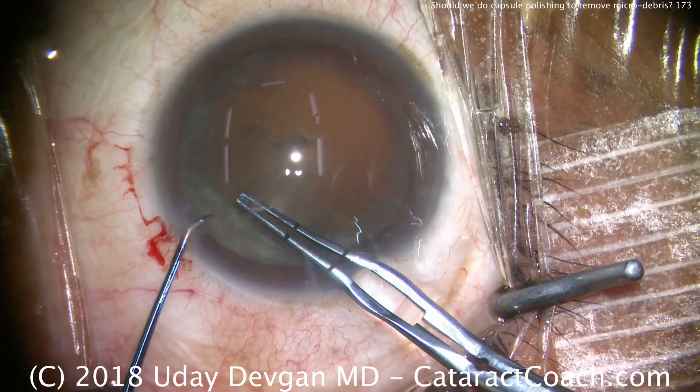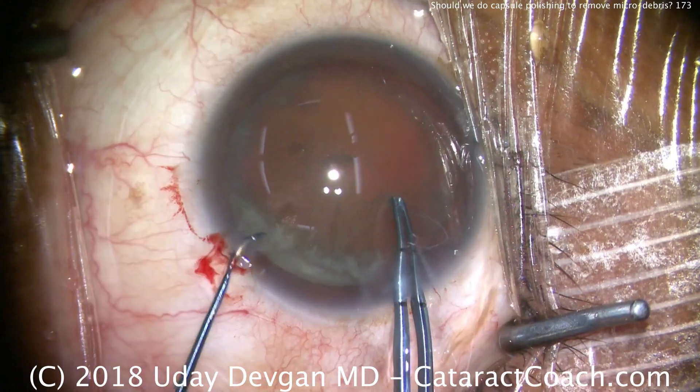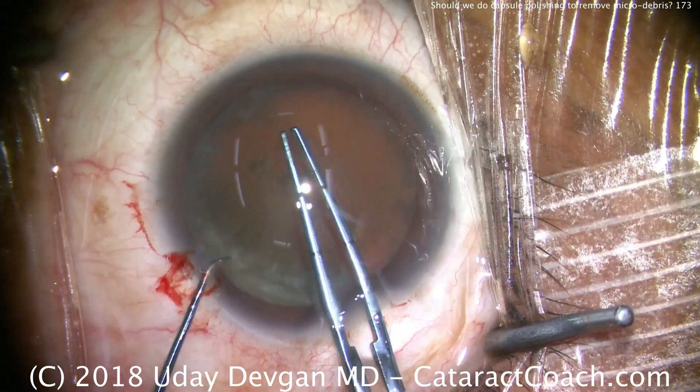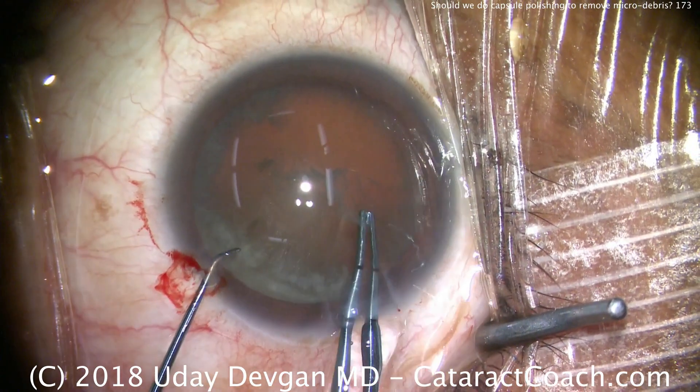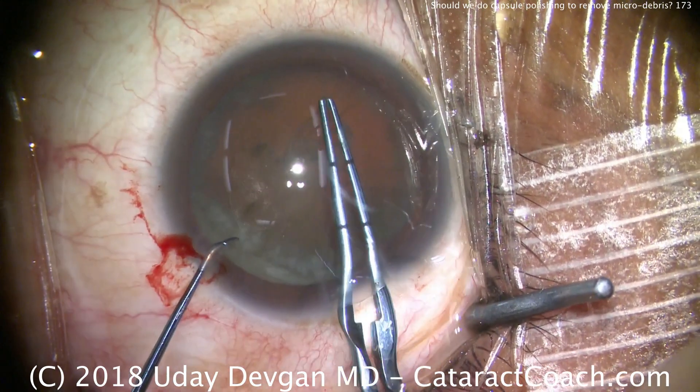Notice how I grab it and go through the area of opacity, and don't let go until I can see it again. That's important, because if you let go of the capsule over that opaque area, it'll become very difficult to re-grab it. So you don't want to have that issue.